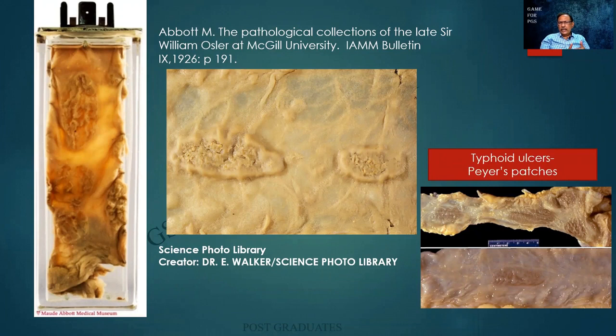It is not like an undergraduate. As a postgraduate, you are supposed to be rattling off. There will be a point when you cannot answer. That is your end point.